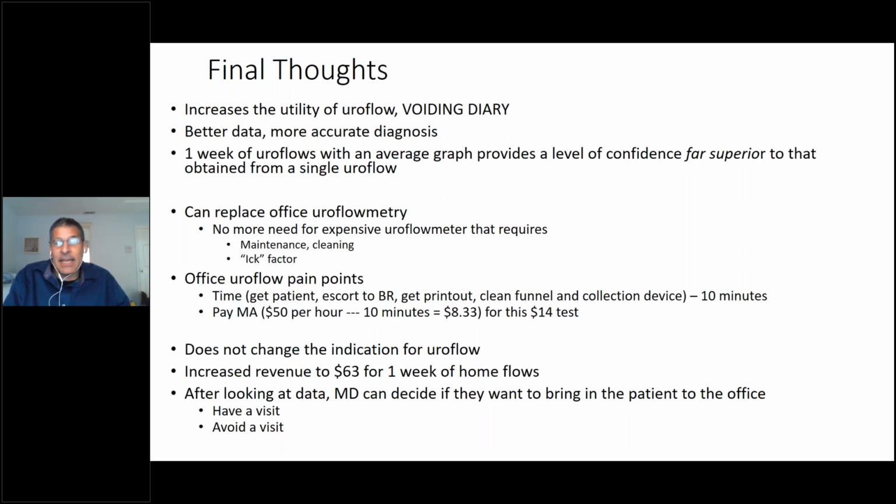One of my pet peeves is when we do a clinical trial and they say we want an electronic voiding diary. Well, it's not electronic. It's entered by the patient into an electrical device. And we've had studies, specifically the Mirabegron study, where 100% of our patients were excluded because they didn't do the diary accurately. You get locked out because if you don't enter your void within a few minutes, you didn't void. But this is a true electronic voiding diary because it catches it in real time.